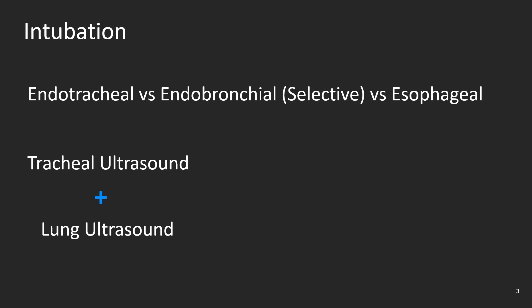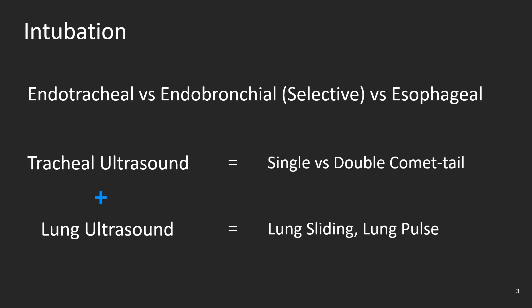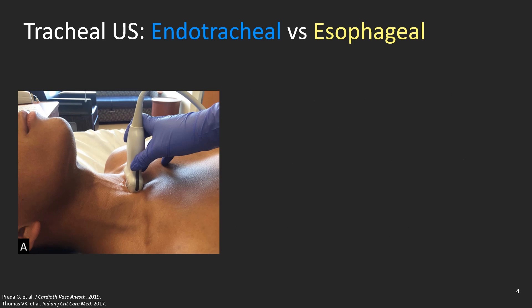With tracheal ultrasound we will look for the single or double comet tail images. With lung ultrasound we will look for lung sliding and lung pulse. That's all we need. Tracheal ultrasound will tell you if the tube is in the trachea or the esophagus. Ideally you should start scanning before intubating the patient and maintain a good image during and after intubation. Place the linear high frequency probe just above the suprasternal notch perpendicular to the trachea on a transverse orientation.